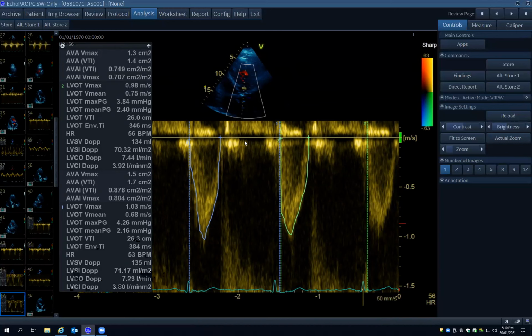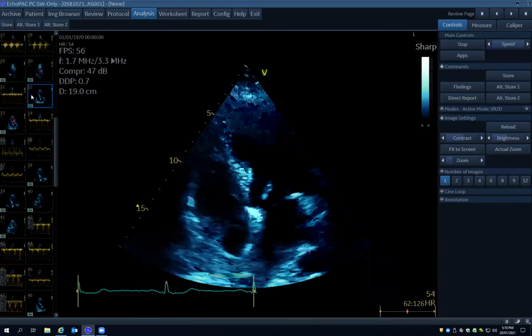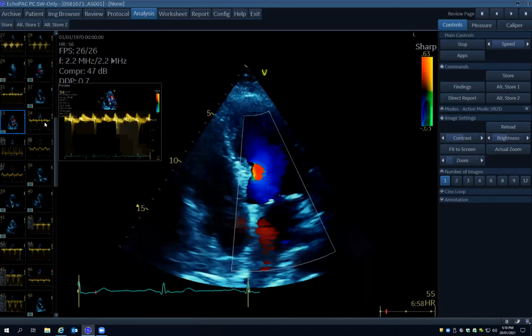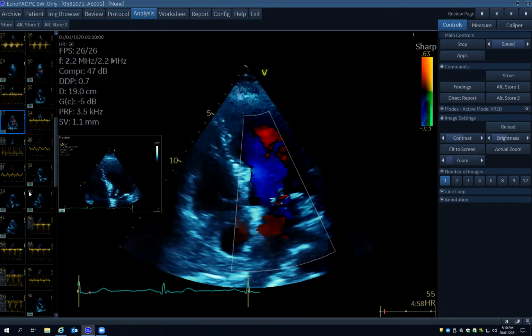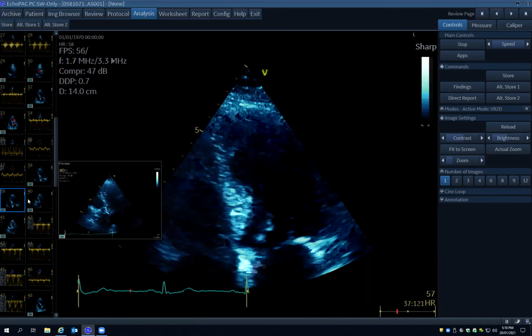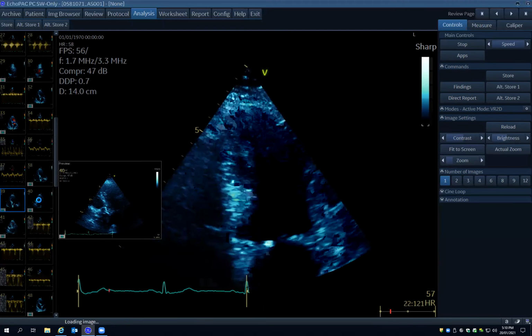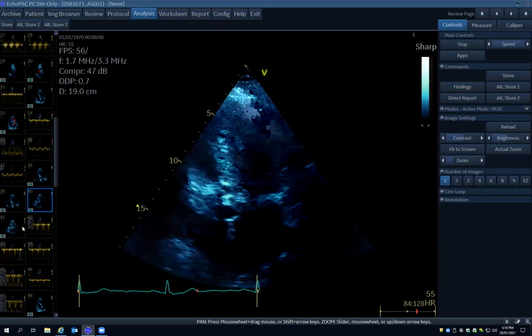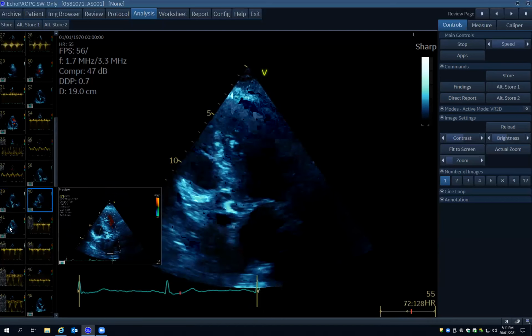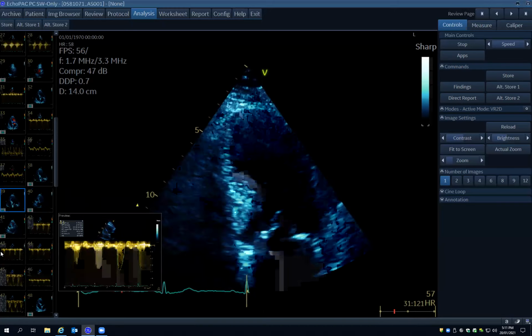Yeah. Nice. All right, well, while we're down here in the apical 5-chamber view, I guess let's have a look at some of this. So this was some of the first views that we're going to get for assessment of the aortic stenosis. Let's go from here. So apical. And I think probably there's two important points here. One is that your LVEF is preserved, which means you're not dealing with low flow, low gradient situations where even a low gradient can be a marker of severe aortic stenosis. And two is that you have a reasonable cavity size.